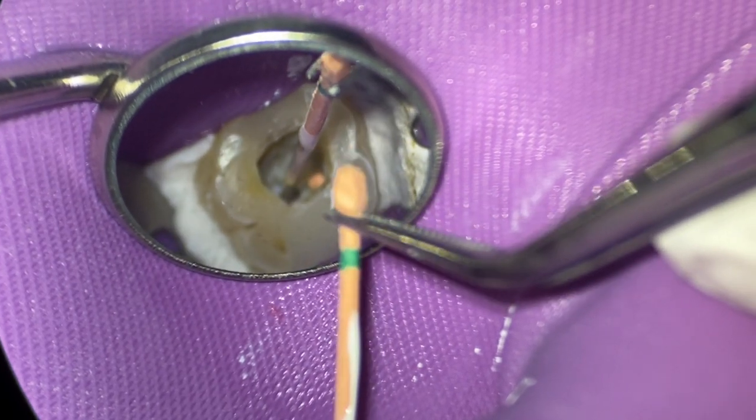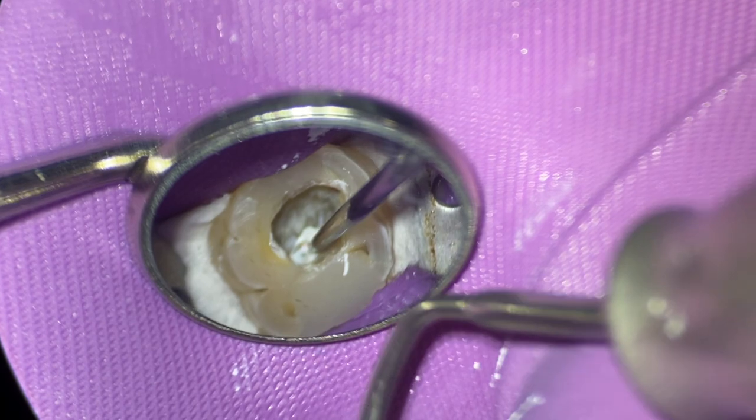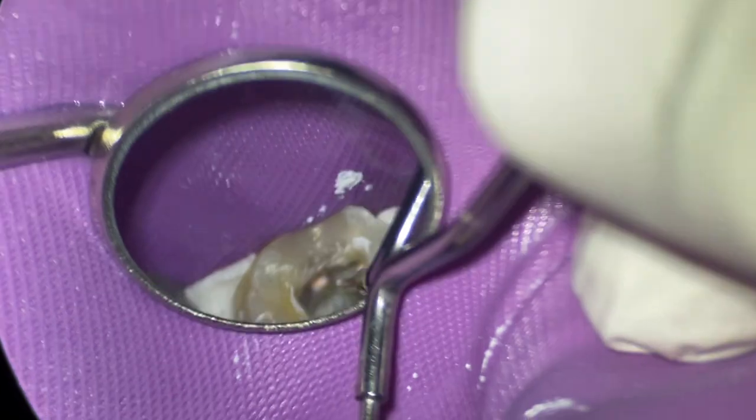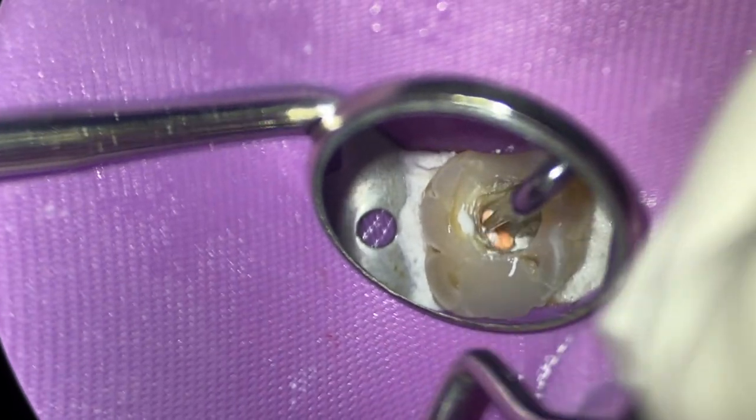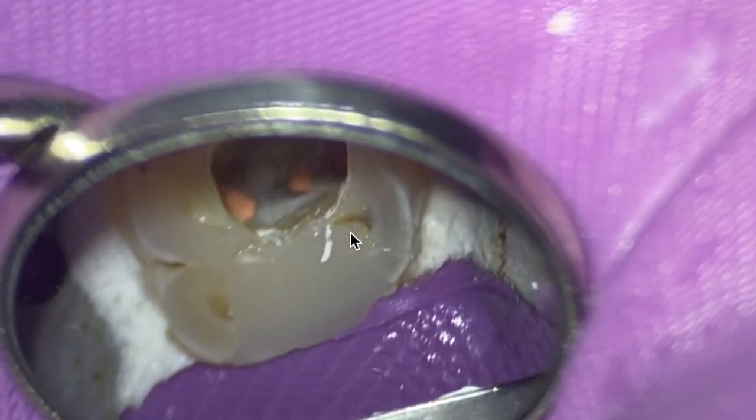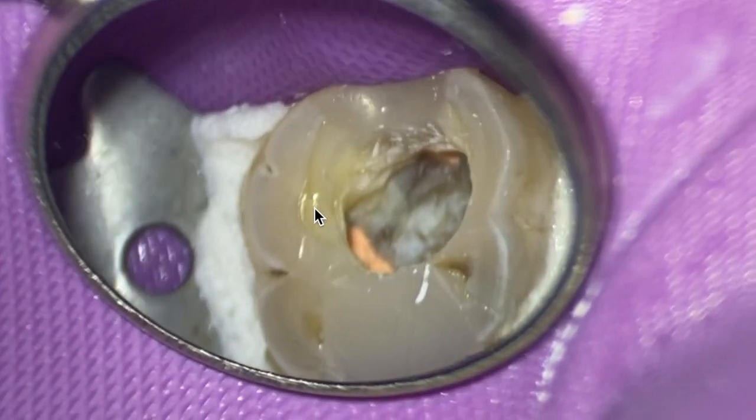You can see I've really pinched off, see a little pinch on my gutta percha, so I know I put it right down to length. Put a couple gutta percha points into the palatal canal because it's large. We'll take a radiograph. I'm going to sear. Now we're going to sear that off. Whoa, that was really fast. I've just used some pluggers, just kind of seared off the coronal portion. And then, oh yes, there's my distal buccal canal, the second piece of gutta percha came flying out. So yeah, it happens. We're going to sear that back in and our gutta percha points are all soaked in alcohol—actually sodium hypochlorite. They're soaked and then rinsed or wiped off to disinfect them. So I'm just making everything look really pretty here. So there's our MB2. It's not really in focus. Distal buccals, palatal, and then our MB1.